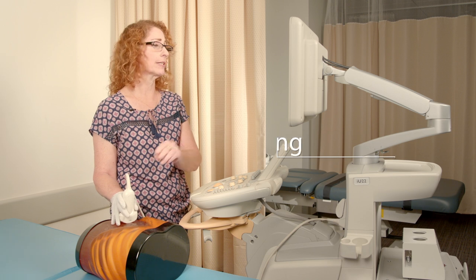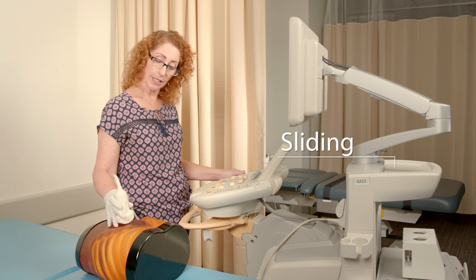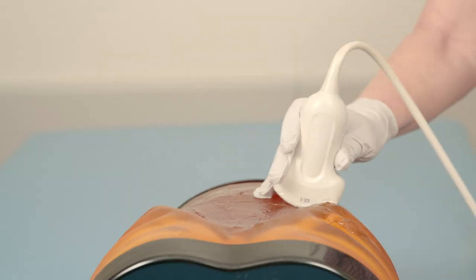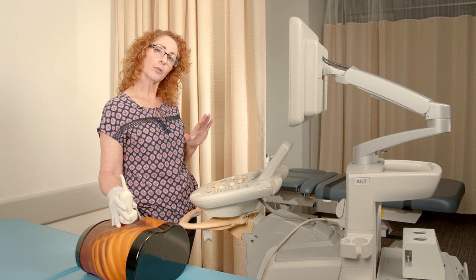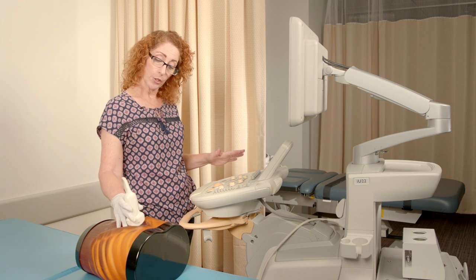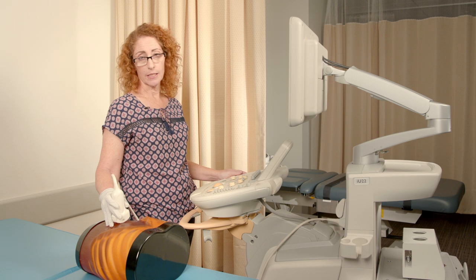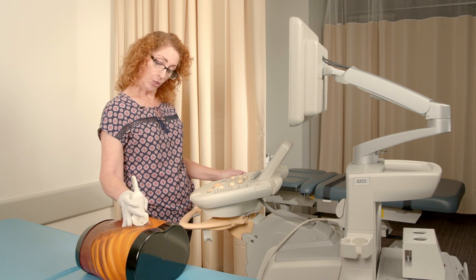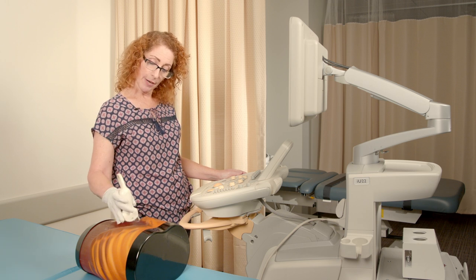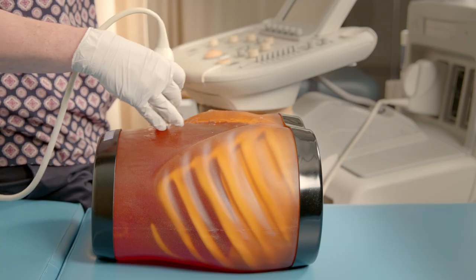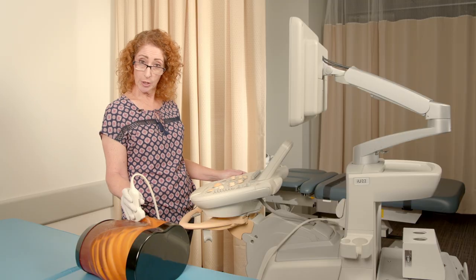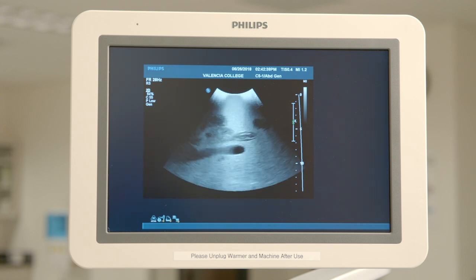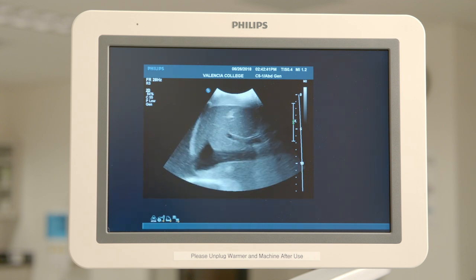The next maneuver is sliding. Sliding is the gross movement of the transducer across the field of view. Where it's possible to evaluate a small organ using angling, sliding needs to be used for a larger organ or a much larger field of view. Sliding can be done in any direction — superior to inferior, medial to lateral in either direction. Sliding enables the sonographer to utilize different acoustical windows even for the same organ.